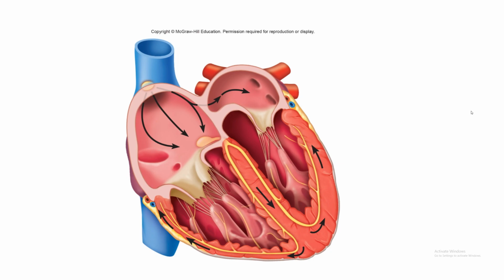And that's also why your QRS doesn't just keep going up because it's getting more positive. It goes down again, right? Because all of this tissue, the bundle branches going into your Purkinje fibers, is becoming more positive. The signal moves down here, right? But then it has to turn and innervate the rest, and it has to go through the rest of the Purkinje fibers, right? So that positive signal is going to go back towards this negative electrode, and it's going to cause that downward deflection. So that's why your S wave is going downwards, right? That's why it starts deflecting downwards.